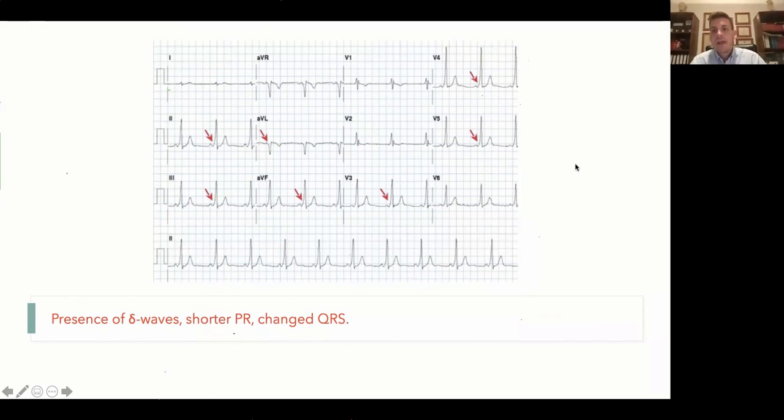Actually, those people don't necessarily have impaired cardiac output because it's usually mild. So Wolff-Parkinson-White patients are found asymptomatically, mostly in young patients. When you find this asymptomatically, and there's no problem with the cardiac output, you do an ablation and disable the accessory pathway, Lucas, before they usually start to present with problems with their cardiac output, because you can see this on an ECG.